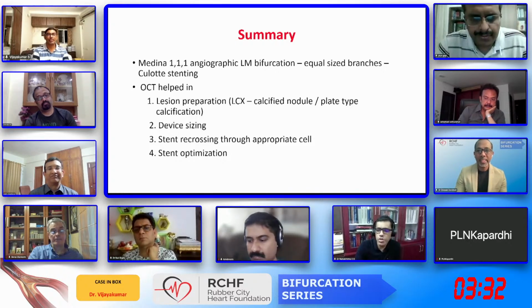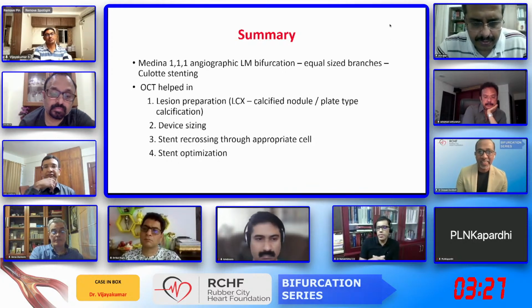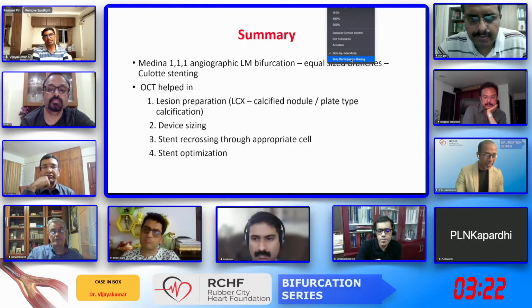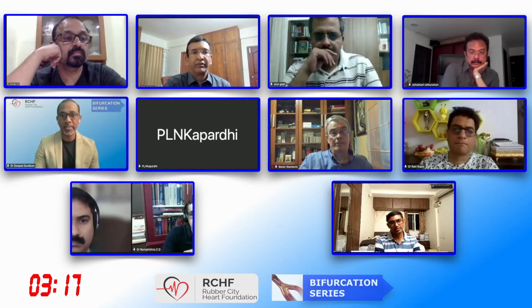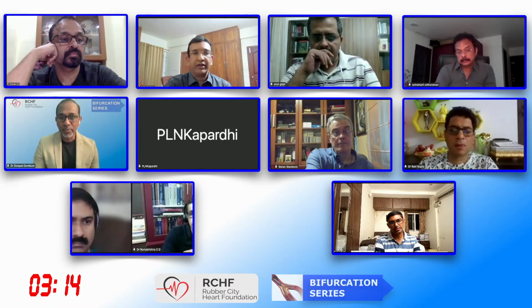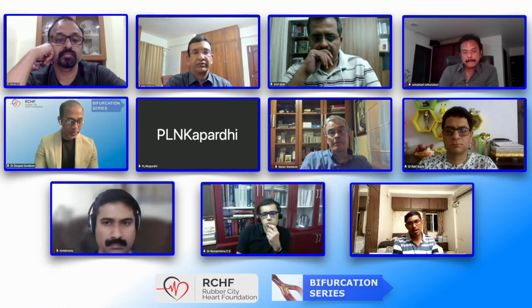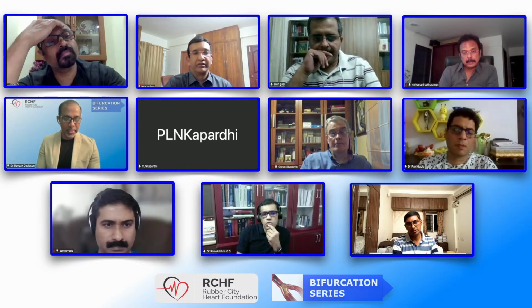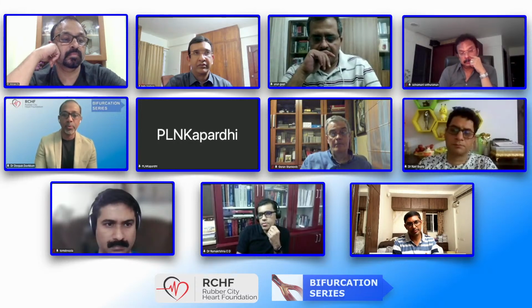So there are 2 questions in the chat box. The experts as well as moderators can comment on this. Number 1 by Dr. Ramchandra Naik: for these sort of complex interventions, what would be the ideal way of puncturing the femoral? The conventional technique under fluoroscopy, or ultrasound guided, or like what Vijay has done using a micropuncture technique? And the second question by Dr. Ramesh Natarajan: will inverted T be a choice if the circumflex is a little smaller, something like 2.5 millimeter in this situation?